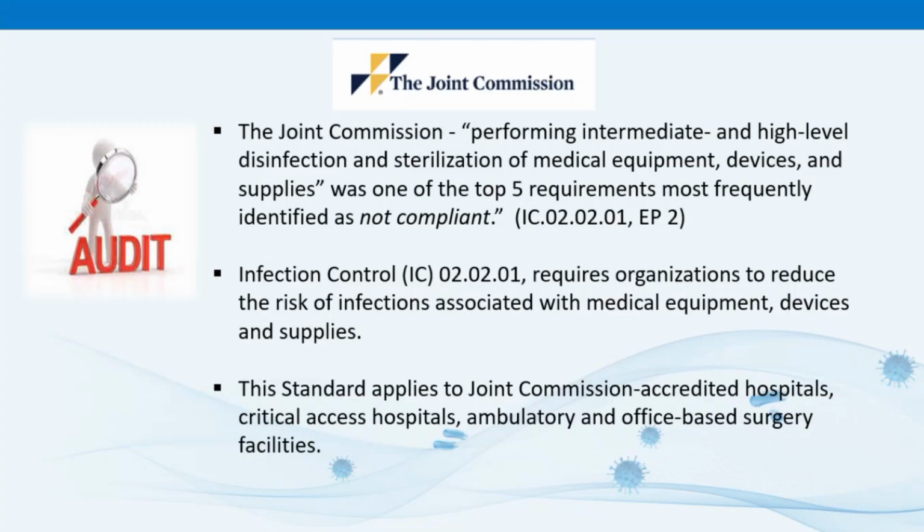Now, to navigate the challenges in high-level disinfection, we should identify what they are. And one way to do this is to review findings from audits of the process. In 2022, the Joint Commission stated that performing intermediate and high-level disinfection was one of the top five requirements most frequently identified as not compliant. Now, non-compliance with HLD is typically higher than lower intermediate-level disinfection because it's so much more time-consuming.